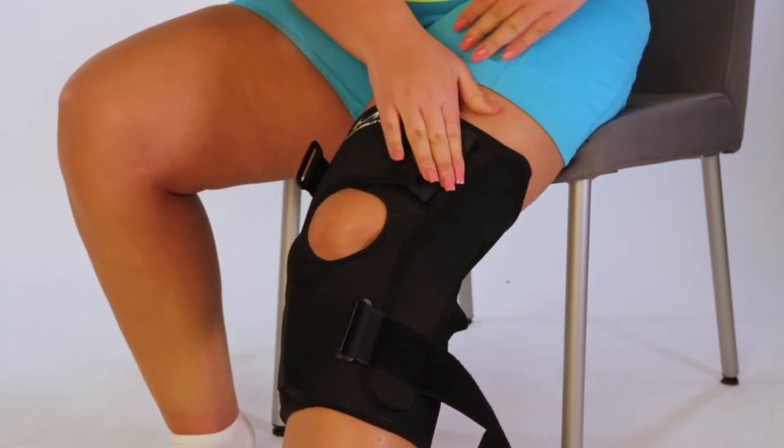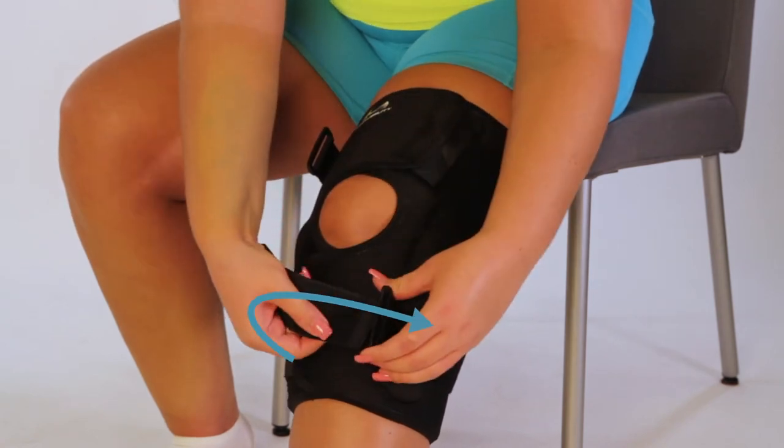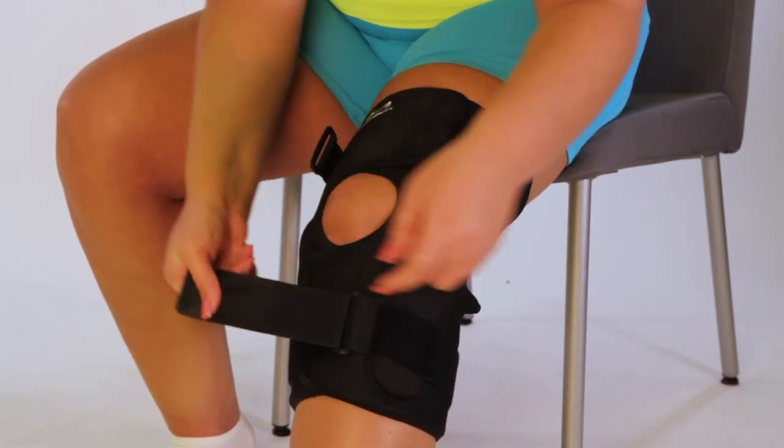The opening should be around the kneecap. Wrap the bottom strap around the calf, feed through the D-ring and secure. Repeat to secure the top strap around the thigh.